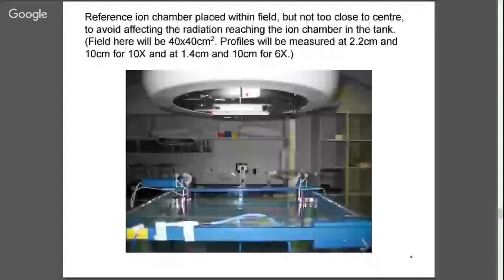One thing worth pointing out is that as we scan, we're actually measuring at different points in time, and the radiotherapy beam is dynamic. There will be small variations in the output of the machine, so the symmetry and, for example, the flatness and depth doses might change, hopefully within a very small tolerance over time.